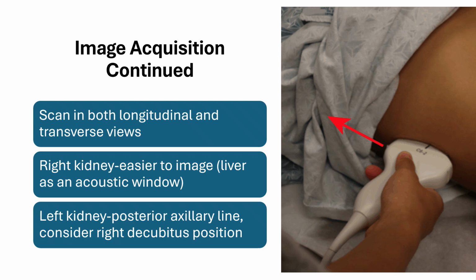Sometimes, in order to optimize the visualization of the left kidney, and if the patient is able to do so, you can consider a right decubitus position.